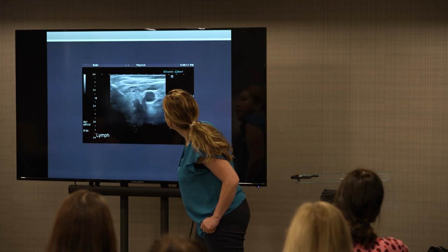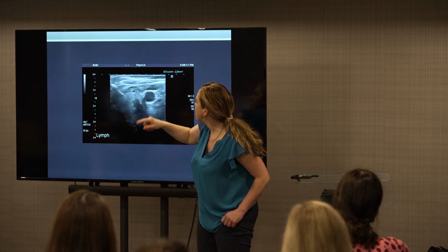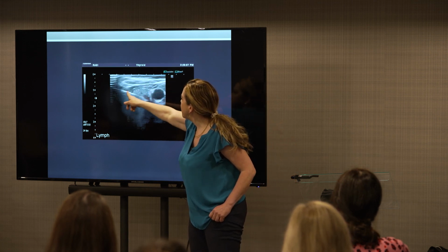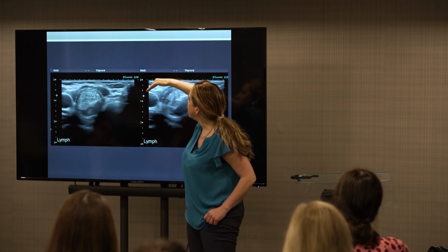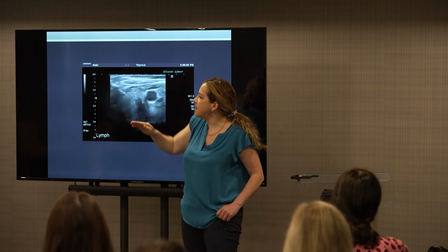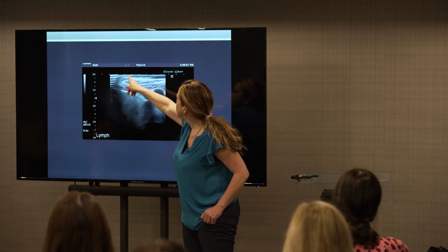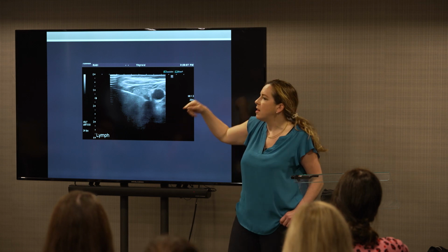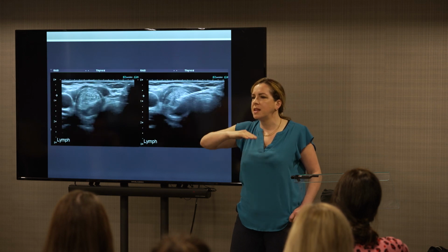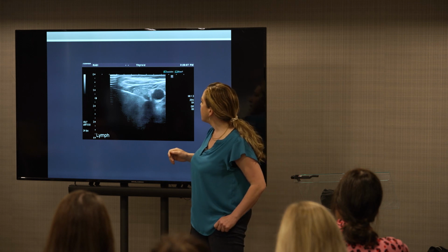Okay, all right. So this one, I've just got to put the needle in here. Can you go forward a couple and go back? I just wanted to illustrate parallelism. When you put a needle in, the more parallel your needle is, and then go back again. I'm doing quite a minor manipulation of the needle inside the tissue, but you can see as it gets more parallel to the probe, you can see it much clearer. If you're going in with a really steep angle, you're not going to see your needle. So you have to plan your approach well. Parallelism is key. Okay, next.